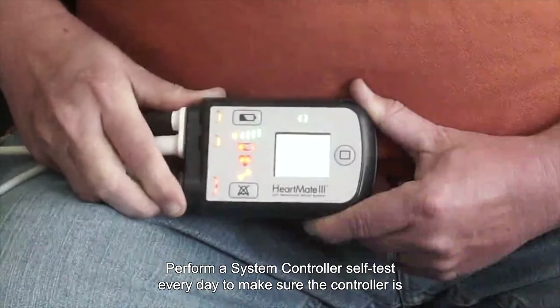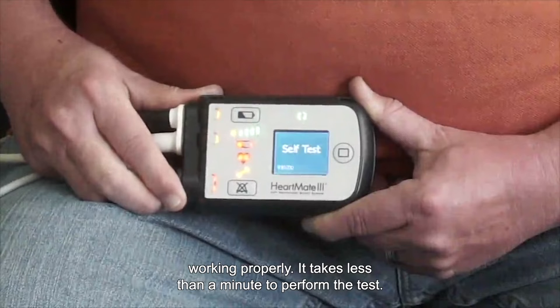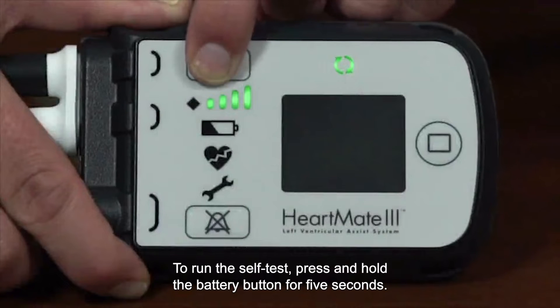Perform a system controller self-test every day to make sure the controller is working properly. It takes less than a minute to perform the test. To run the self-test, press and hold the battery button for 5 seconds.